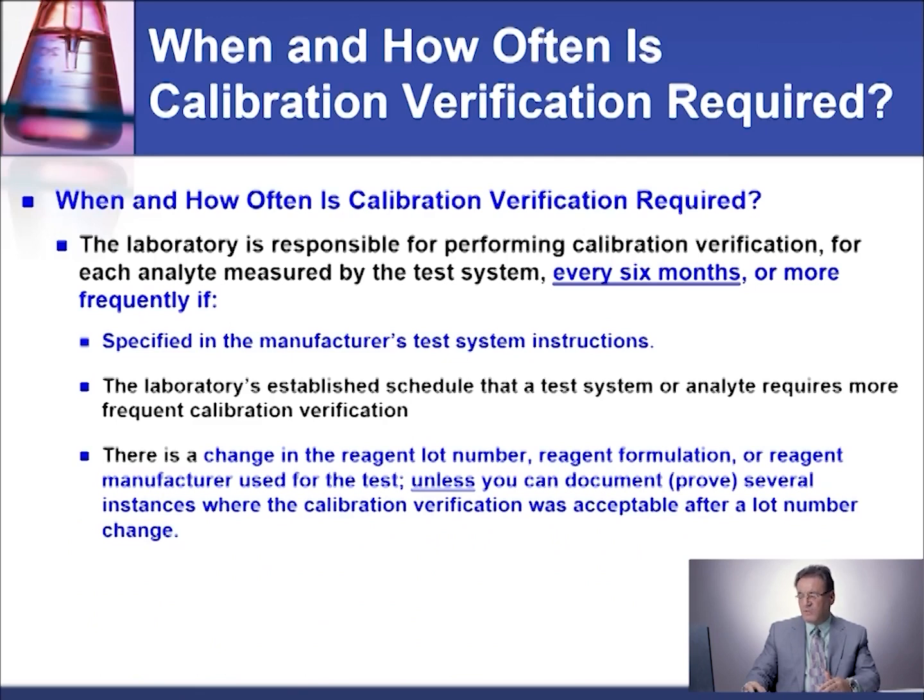There is a change in reagent lot, reagent formulation, or reagent manufacturer used for the test, unless you can document proof that the change of reagent does not affect the calibration verification.